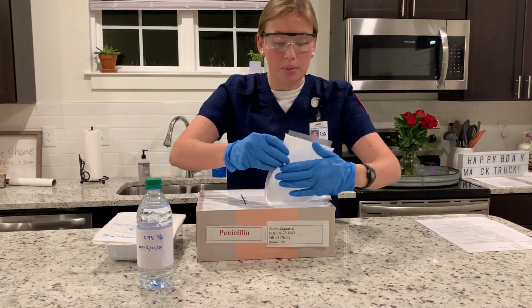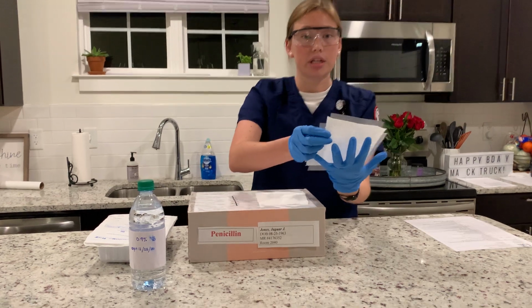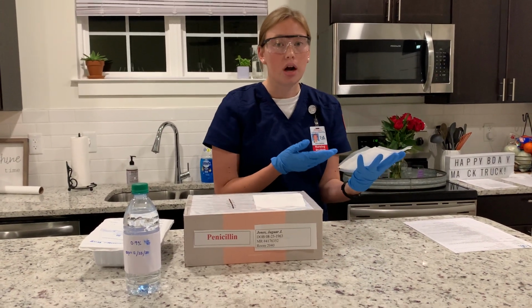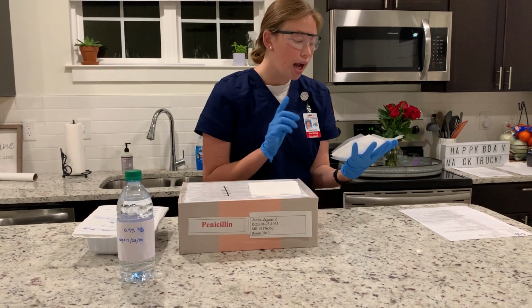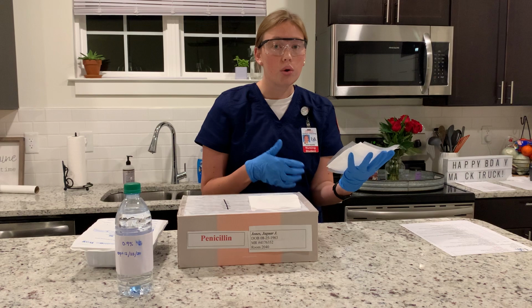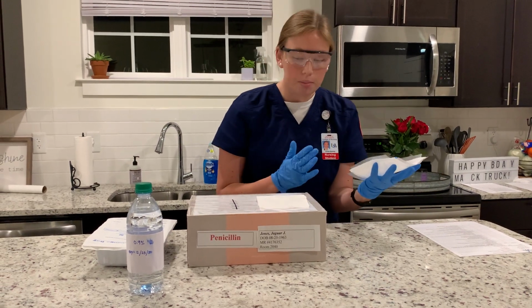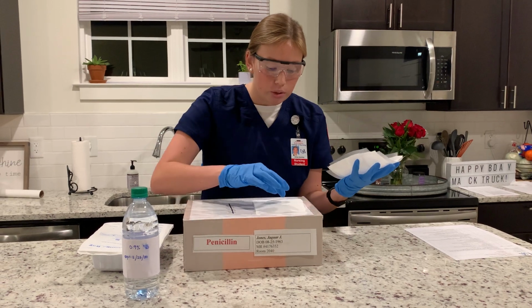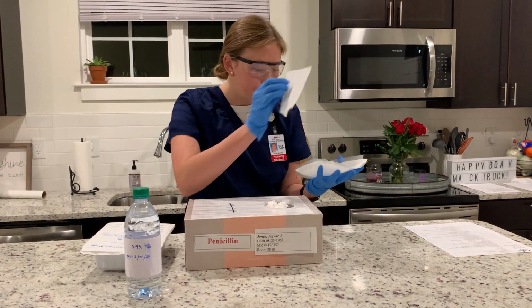And then I'm going to lift the ABD pad away from the patient where the dirty side is facing towards me. I will then assess the drainage on the dressing. I'm looking for type, amount, color, consistency, and odor. And then I will document whatever I notice or any abnormalities. Then I will take off the inner packaging.